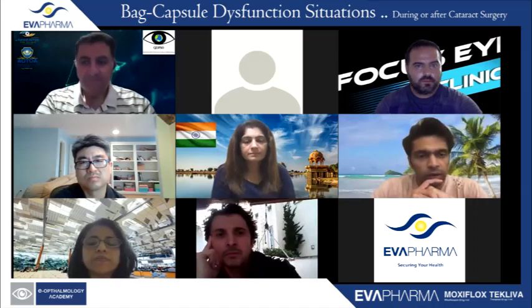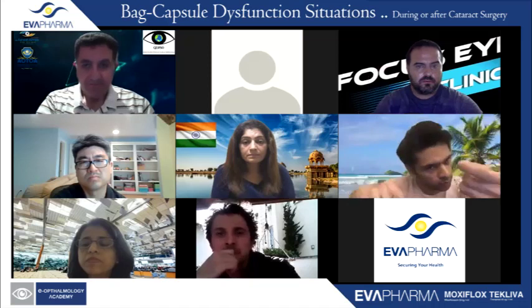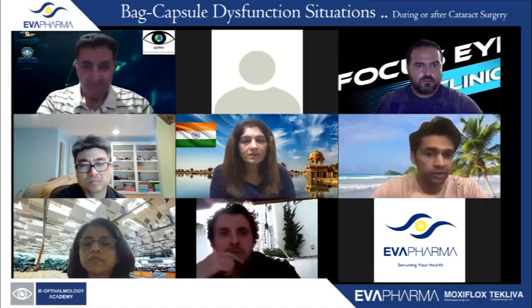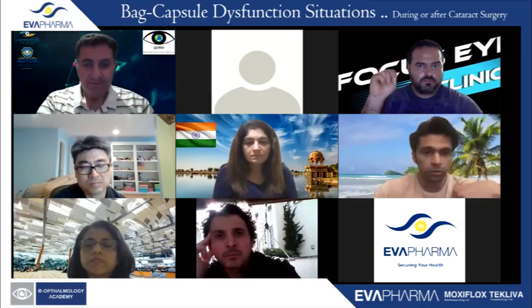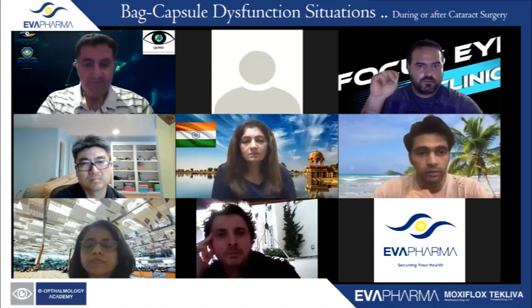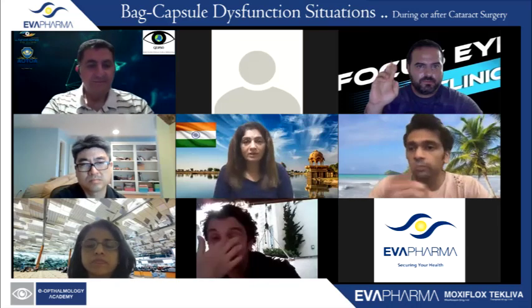In fact, I would suggest putting in some iris hooks and removing it from inside. You don't even have to open the outside if you want to explant. That's a good trick, I always do this. I just take it from inside and pull it into the eye. It's so easy, it comes like butter. The haptic tract remains open.